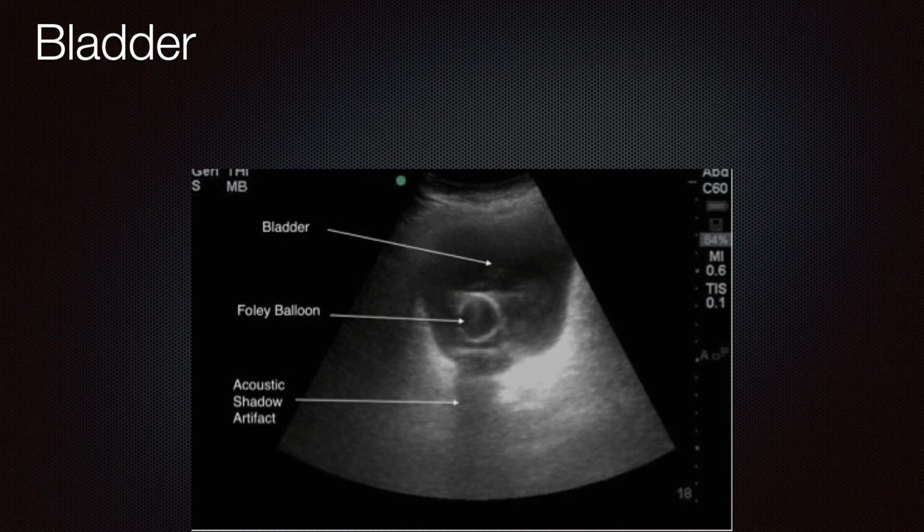And then next, you might get a case like this where the nurse says the patient has bladder outlet obstruction. They put the Foley in. They're not producing urine. They're not sure what's wrong. So you can just come with your ultrasound and look, and you can see the Foley is here in place. It's within the bladder. This is just an obstructed bladder, and I've run into that a few times when the patient has hematuria. So you just need to flush it or possibly replace the Foley.